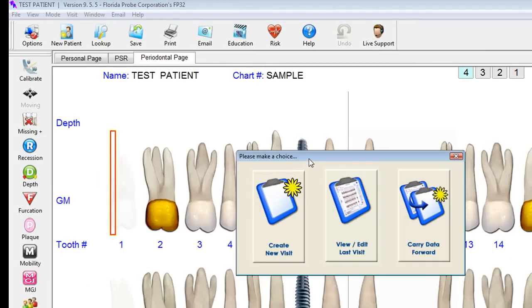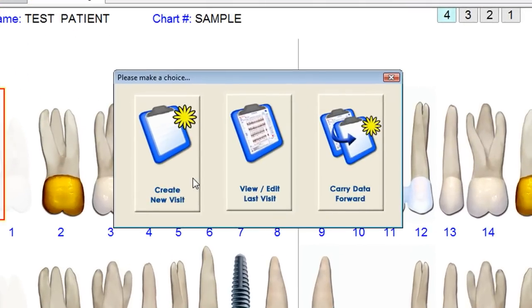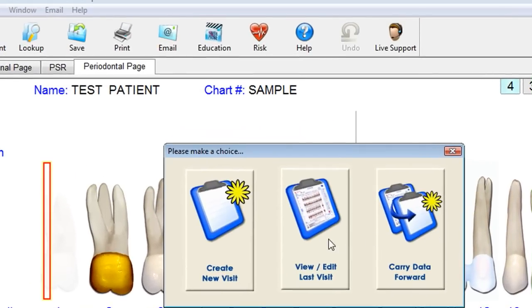Our three choices on this dialogue are to create a new visit from scratch, view their previous charts — maybe print them out or email them to the insurance company — or carry data forward from a past visit. For a re-care visit where we want to save time, we're only going to enter pocket depth and bleeding data, but it allows us to bring data over such as furcation, mobility, and recession. For this demo, let's just look at their previous chart.